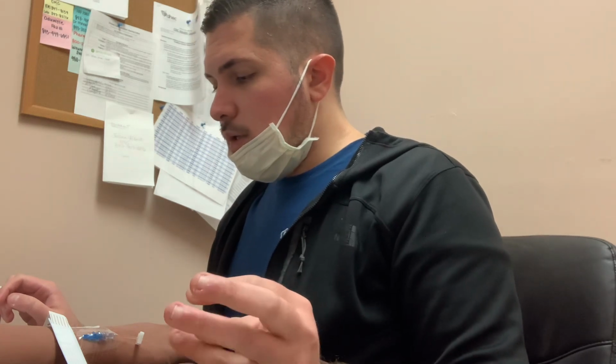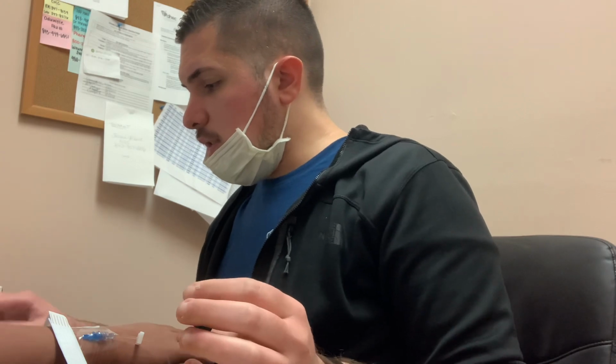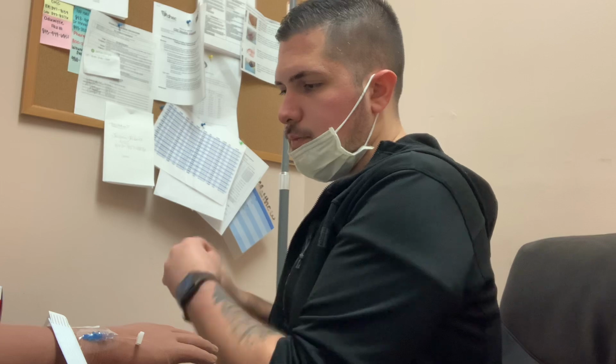We're going to be giving you some IV hydration of normal saline. It's going to run over 4 hours. This will just help you to be more hydrated. So now we're going to start. We're going to hand sanitize again, wash our hands.